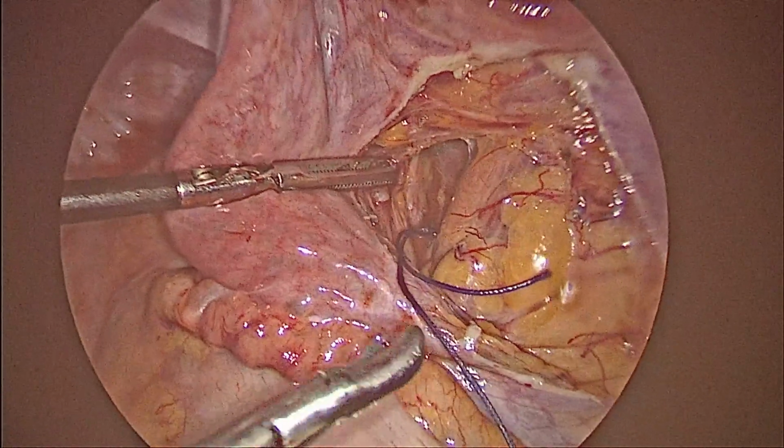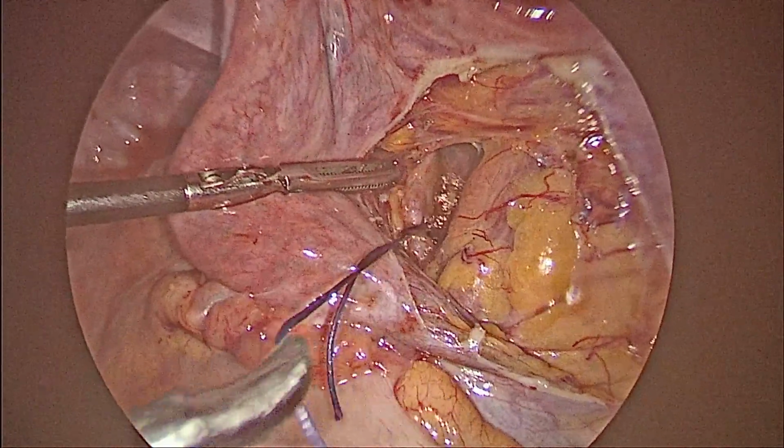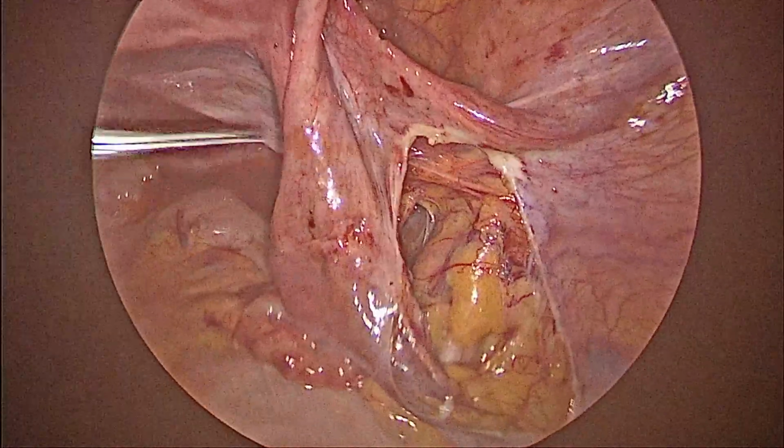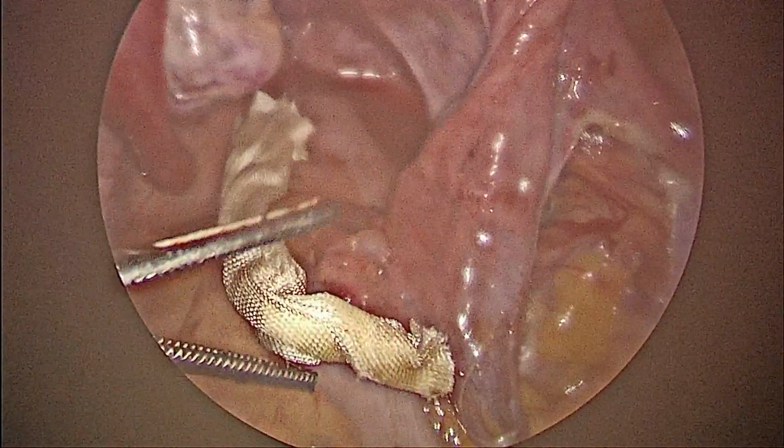So this is a very good way to prevent the uterine artery supply to the uterus during our procedures. So it was done on either side. We are showing it on one side. A similar procedure was done on the other side also.